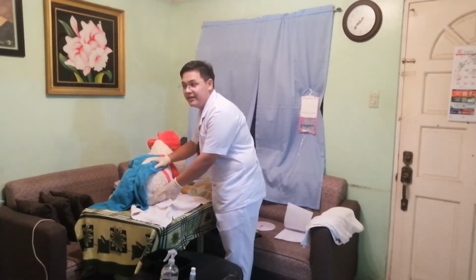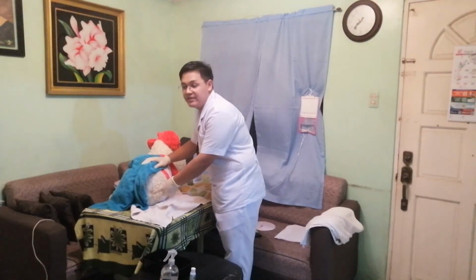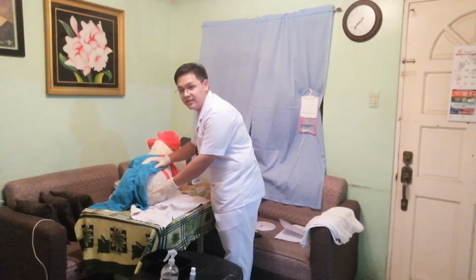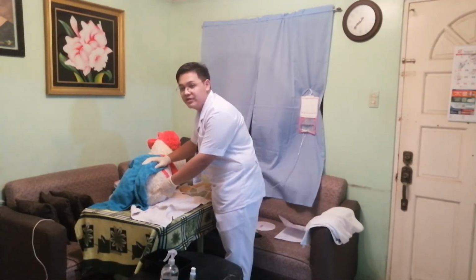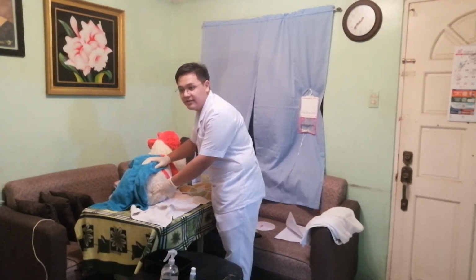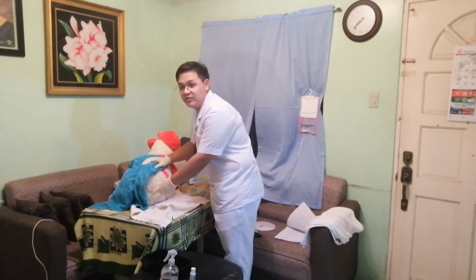And again, if the patient resists or experiences resistance, we will need to end our procedure and report it to the primary healthcare provider. Okay, so now we will be administering the solution.